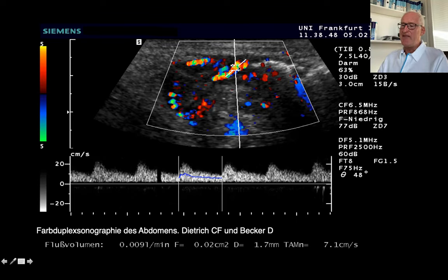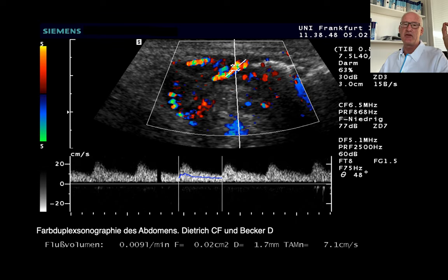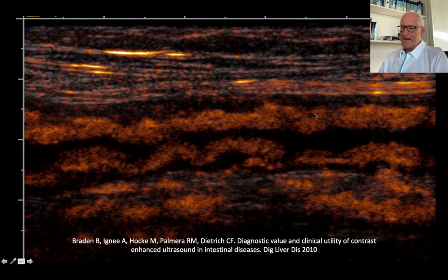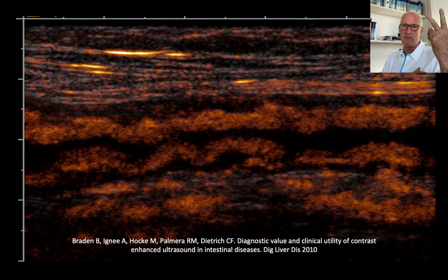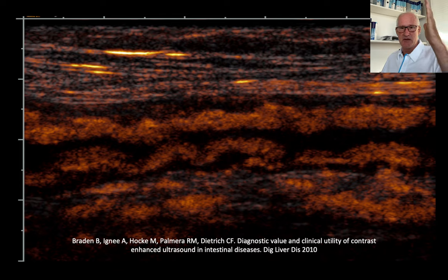In the submucosa you can depict the Doppler spectrum. A pretty high diastolic flow indicates inflammation, whereas if you have only systolic flow, it's a sign of ischemic disease. In addition to B-mode showing the ultrasound layers — mucosa, submucosa, muscle proper layer — Color Doppler imaging shows the feeding vessels and the vessels within the submucosa.